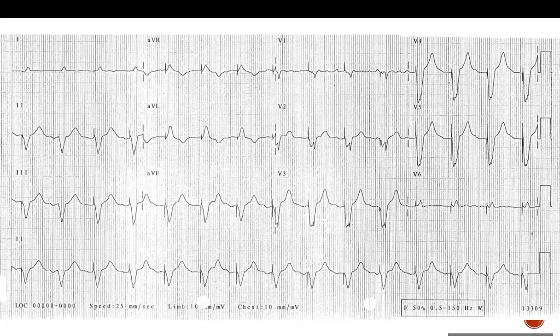To assess the sensing, there has to be something for the device to sense, whether an intrinsic signal or noise from outside. Based on that, the device might behave correctly or incorrectly. The second point, about dual or single chamber: why can't we assess that either? Because it's the same thing. We said how the device functions: it senses and it paces, right?